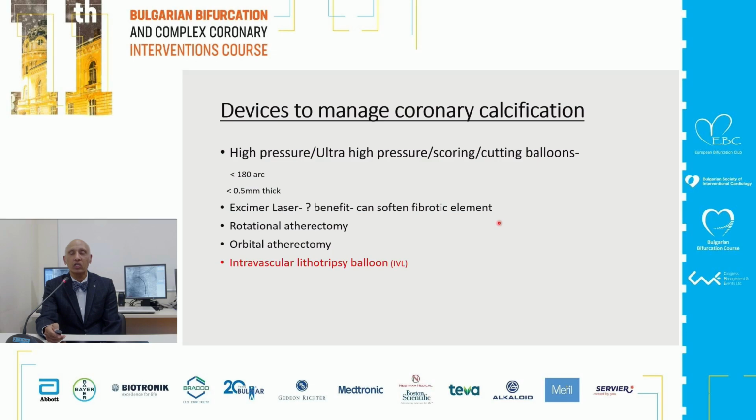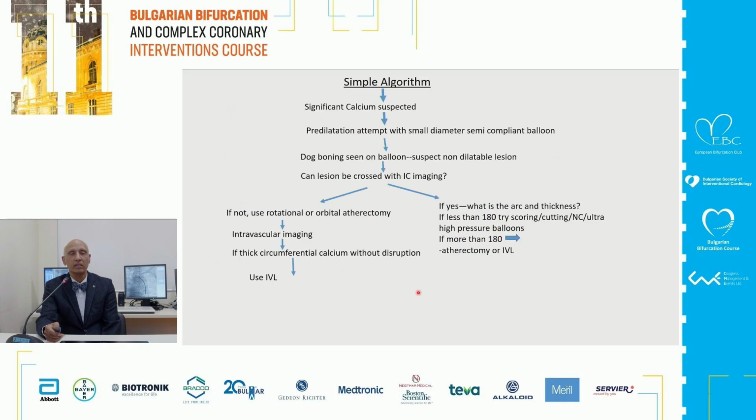How do you manage coronary calcification based on the appearance? There are various devices that one can use, and the latest device on the market is the intravascular lithotripsy balloon. So based on the extent and degree of calcium, you can use the appropriate device.